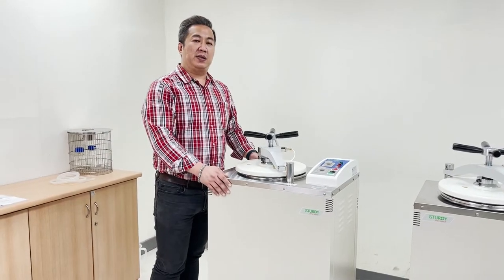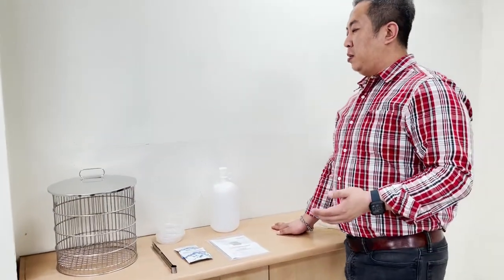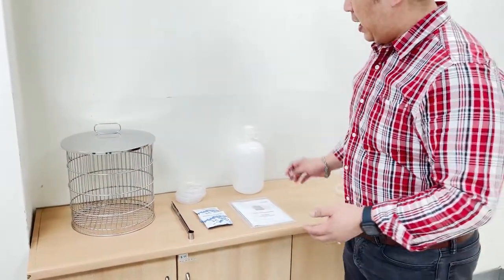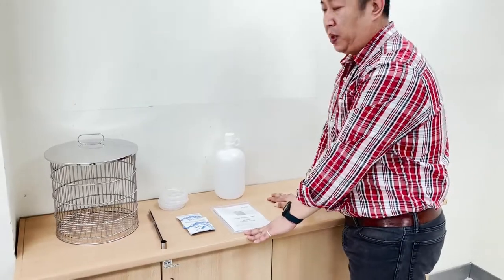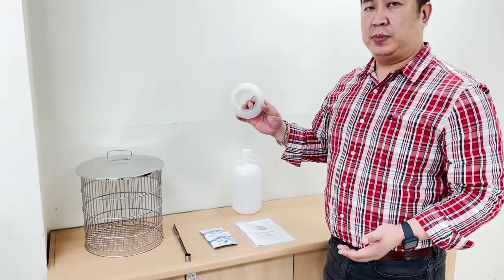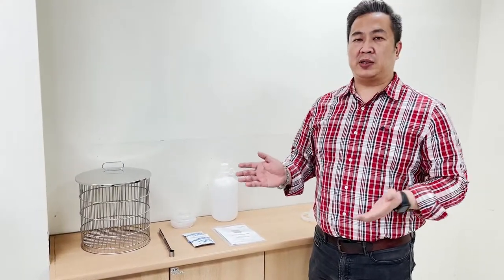Once your vertical autoclave is installed in the right position, confirm that all standard accessories have been received. The standard accessories include a standard basket tray, the top cover, a clip, cleaning powder for the inner chamber, the instruction manual, a water bottle for filling water, and a water exhaust tube that will be demonstrated later. For any additional accessories, please contact your sales representative.